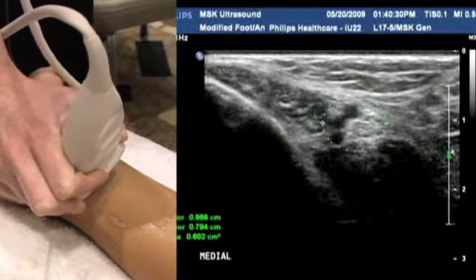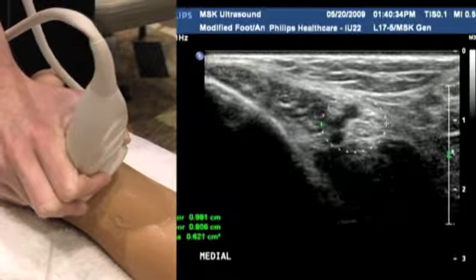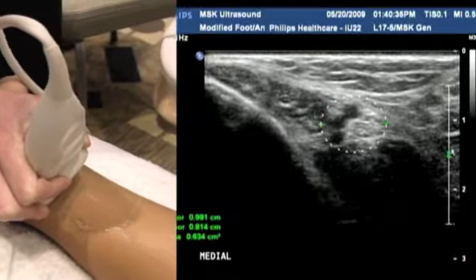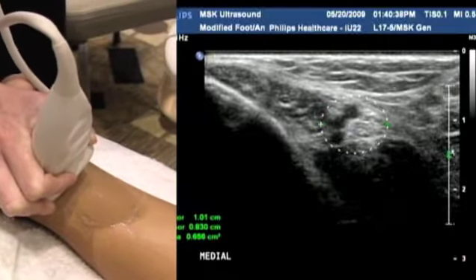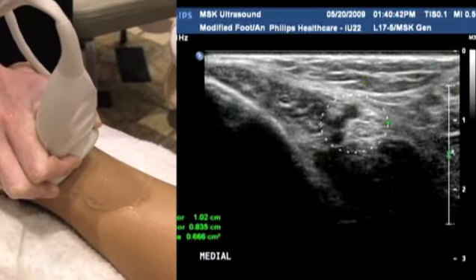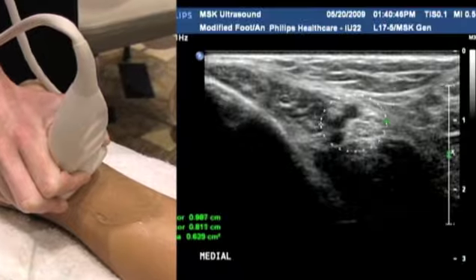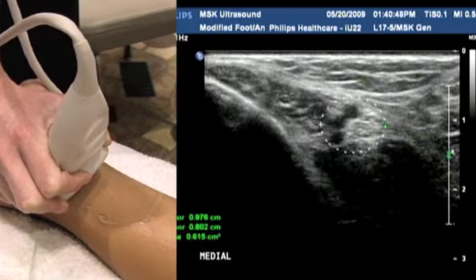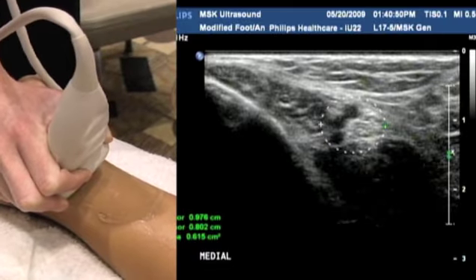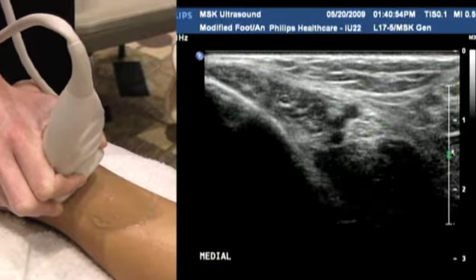Similar to the carpal tunnel in the wrist, anything that's going to intrude on space in this area is a likely cause of pain and tingling in the toes. So anything that's impinging on that nerve, whether it be soft tissue neuroma, whether it be a ganglion cyst, whether it be varicose veins, all of these things are relatively common to see in the tarsal tunnel, something we need to be aware of when we're assessing that region there. So just something to be aware of.